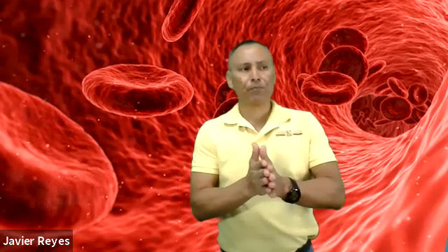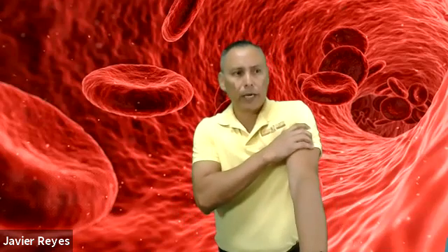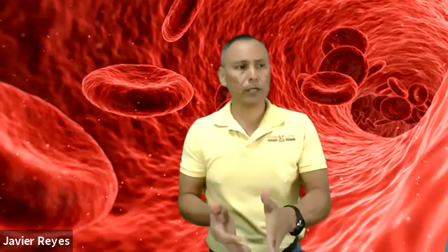So when you apply your tourniquet too long on the arm, you're limiting the blood flow. Remember, the purpose of the tourniquet is only to slow venous return, not to restrict. You don't want to restrict arterial flow. If you notice that the patient's arm is getting reddish or purple, then you probably have applied that tourniquet too long. If the person tells you my hand is tingling or feels numb, you've had that tourniquet too long. You should not apply the tourniquet for more than 1 minute according to the venipuncture procedure. Please make sure you're aware that if you do, you will be causing hemoconcentration.